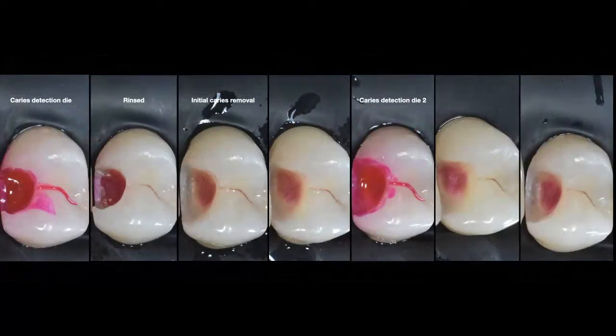There are a lot of publications in that regard, but this is just a sequence to show you how many times I stained this tooth in order to go from that very red stain, all the DEJ, some caries on the enamel and caries on the actual wall, all the way to that nice and clean enamel, good access with beveled enamel on the proximal walls, buccal and lingual box walls of my box, and the gingival floor, clean and nice DEJ, and then again a little bit of that pink and a little bit of a darker pink axial wall.